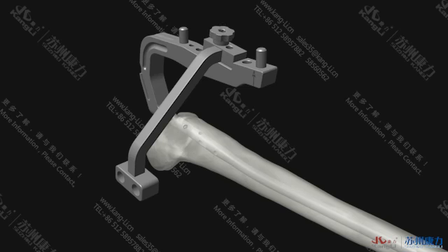Insert the outer sleeve and soft tissue separator into the locking hole of the proximal targeting bracket. Make a 0.5 cm long incision at the place where the soft tissue separator contacts the soft tissue, and then insert the outer sleeve and soft tissue separator until the bone cortex is reached.